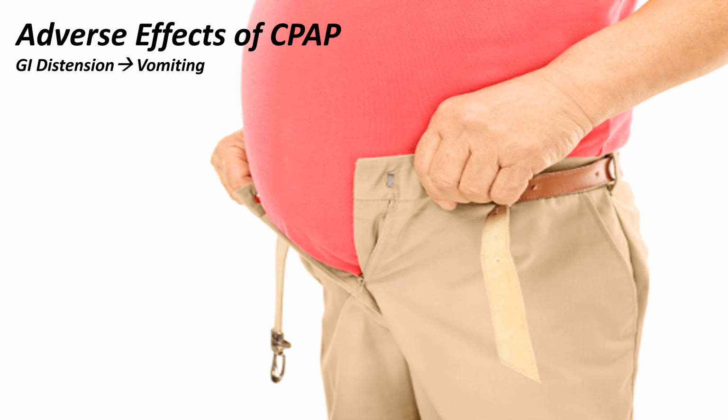I'm sure everybody can probably picture why, but just for the sake of saying it, obviously if we are forcing air into a patient, there is a high potential for some of that ending up in the GI tract as well. Same as when we're bagging a patient during CPR, we always want to be mindful of any GI distension. If you are starting to notice any of that in your patient, same as many of the other adverse effects of CPAP, you can just back the pressure off and see if that helps.